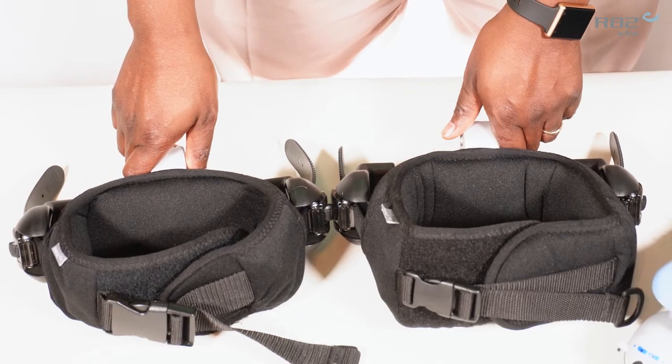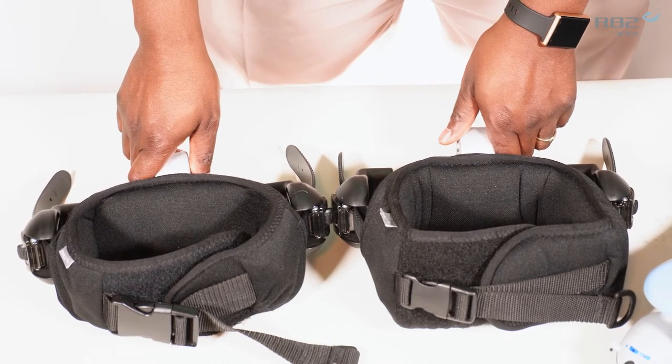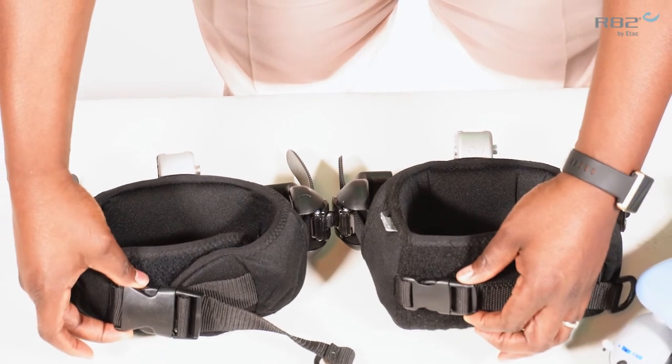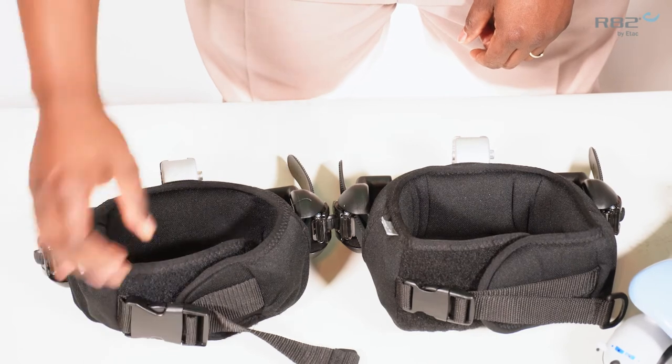The chest and pelvic support look extremely similar. There are a couple of differences. One difference you will notice is the buckle size. The larger buckle belongs to the pelvic support.